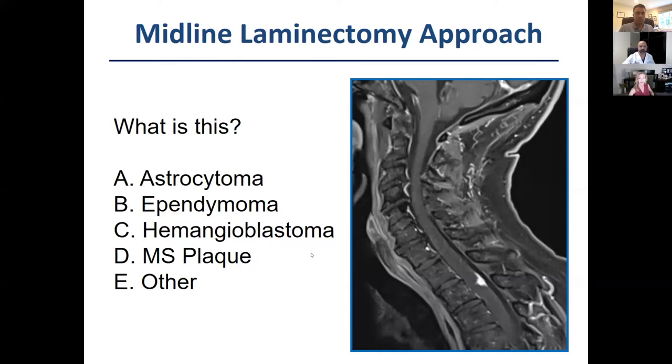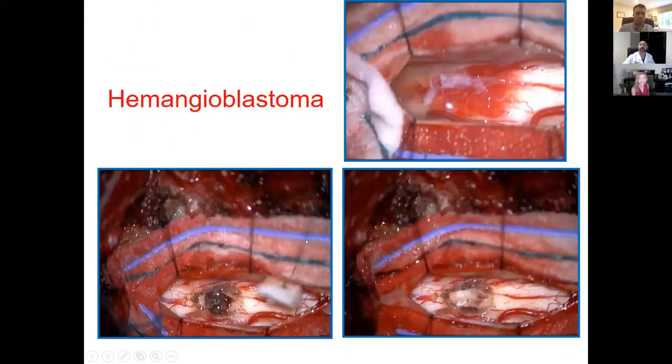Yep. Excellent. You nailed it. Well, I'm sorry, was I supposed to guess? Oh, no, you're absolutely right. So this is a hemangioblastoma. This was actually referred to us. They thought it was an intradural met from breast cancer. It turns out to be a hemangioblastoma.